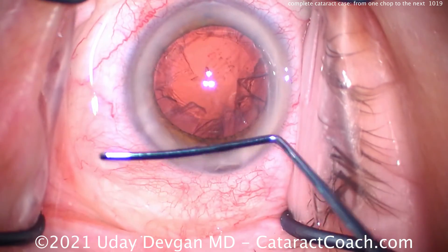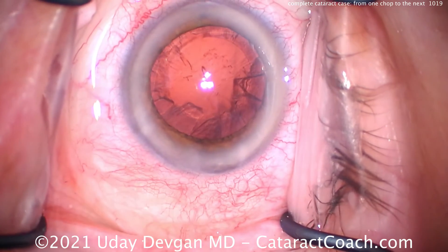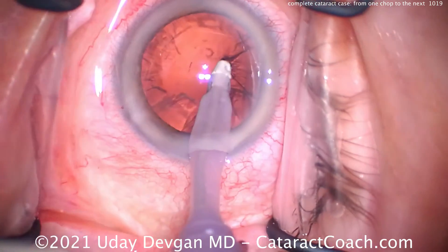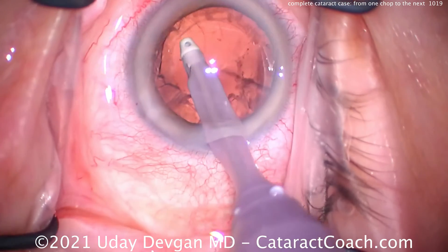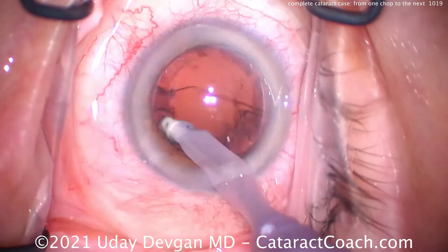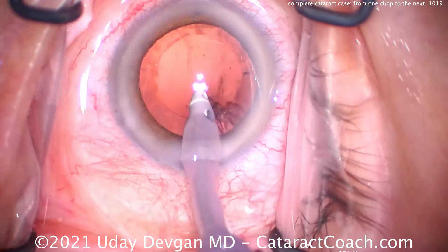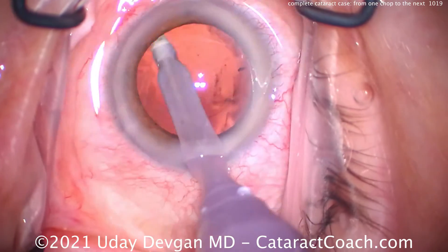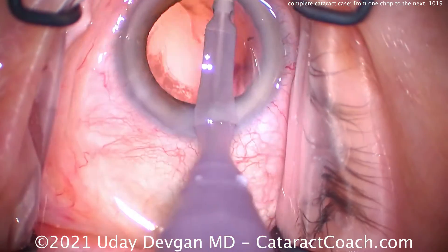That looks great — nucleus out just like that. Watch it again if you need to: that first chop goes down, the nucleus is split, and immediately the probe is re-embedded into that heminuclear piece and chopped again. One chop and another chop and another chop — it's a very simple method to remove the nucleus. You can also understand why I don't typically use the divide-and-conquer technique: so much more energy placed in the eye and a lot less efficient. For me, the most efficient way of nuclear disassembly — also the safest, with less stress on the capsule — is that chop. Chop, chop, and chop, and the nucleus is already broken up into small pieces, easy enough to remove.